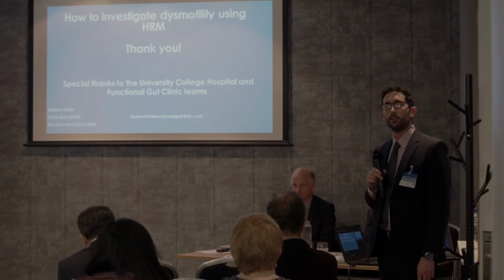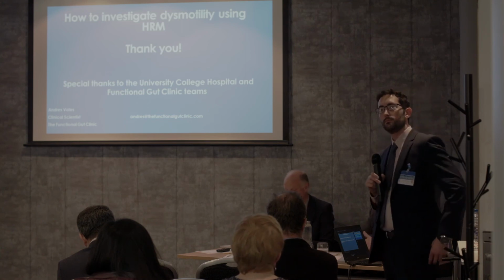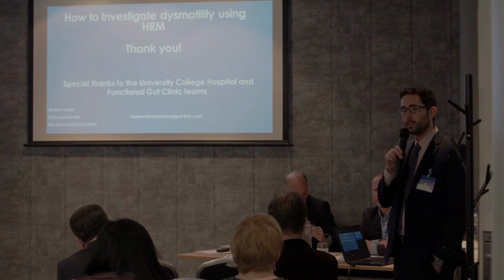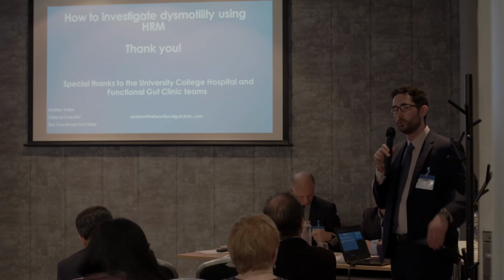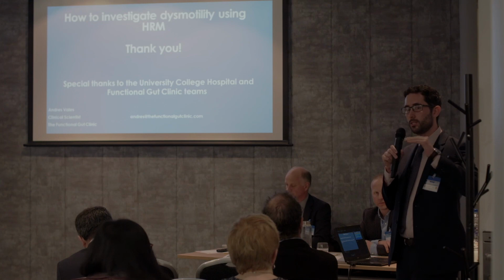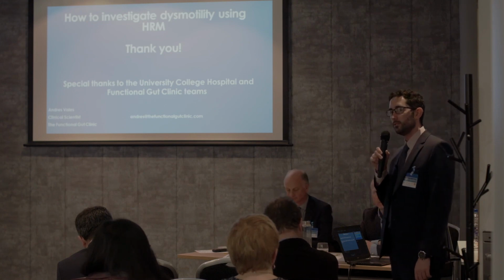Where would you suggest you set your gastric baseline? Because the gastric baseline will be important for the IRP. That's right. So it's a good point there that the software will allow you to move a marker at the bottom of the trace that essentially sets your gastric baseline. And the IRP will be calculated based on this.